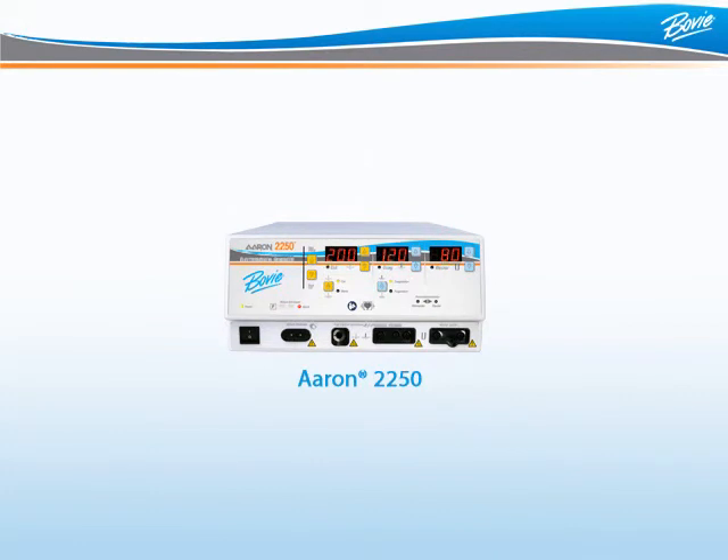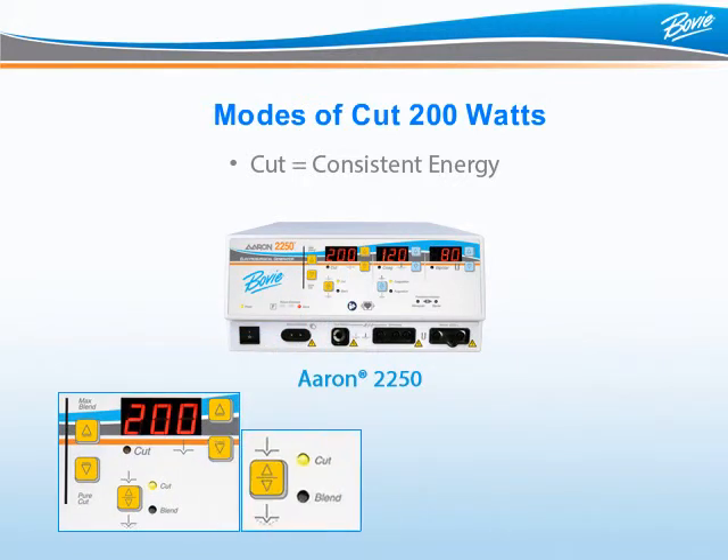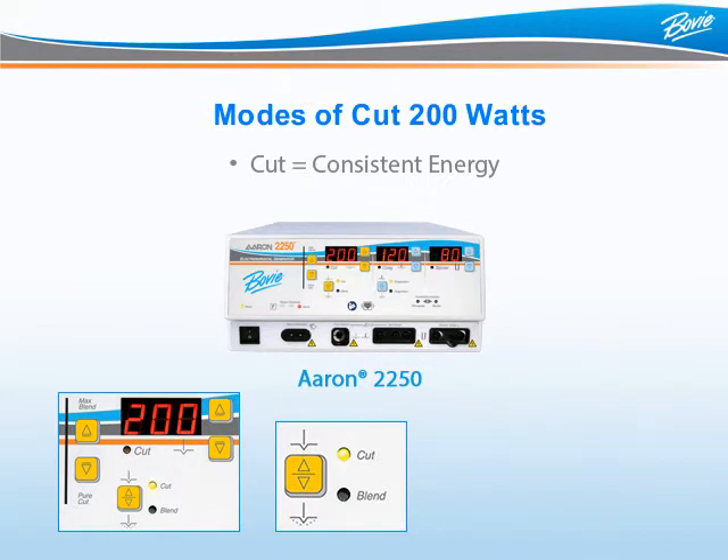The ARIN 2250 has two modes of cut which offer up to 200 watts of power: cut and blend. Cut mode means the unit is consistently delivering energy to cut through tissue. To activate cut mode on the ARIN 2250, press the yellow button with two triangles so the cut LED to the right is illuminated.